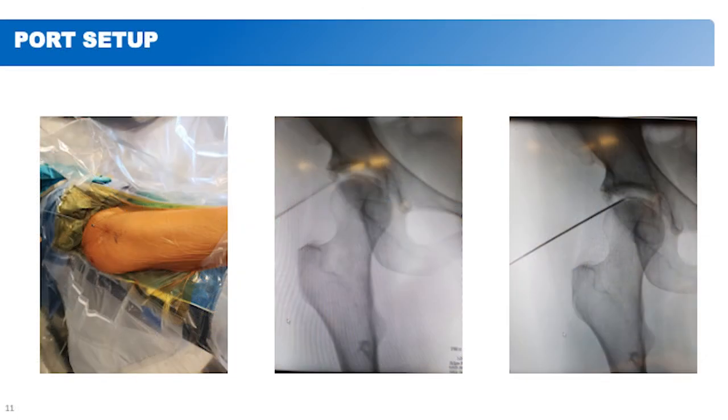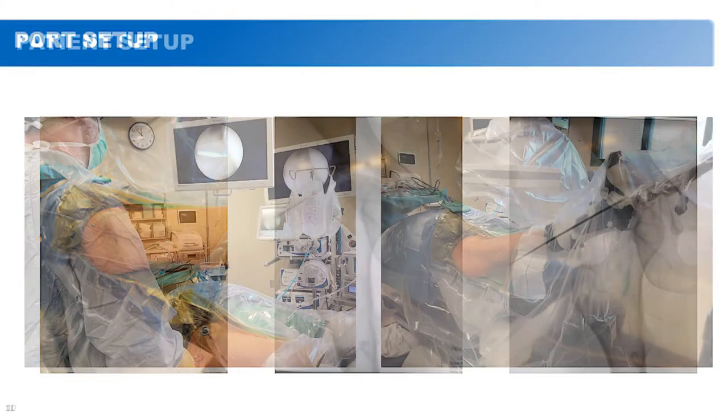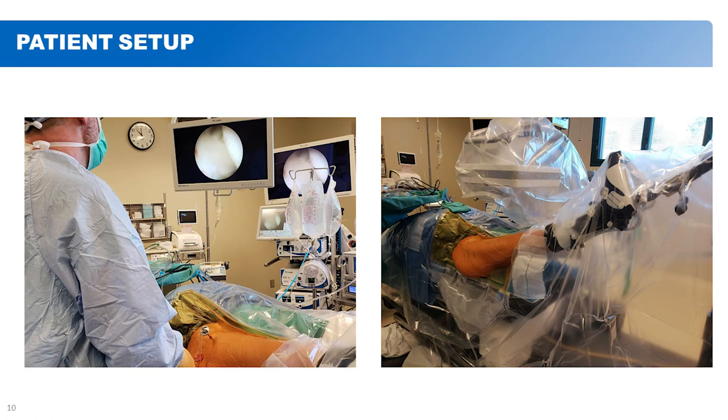This is just an example of a little needle that gets into the joint and opens it up, or the medical term is insufflates the joint, so opening it up so I've got enough space to do the work. So that's a hip arthroscopy, and that's a really effective treatment to treat what I call joint preservation.